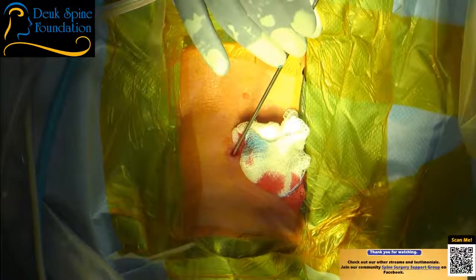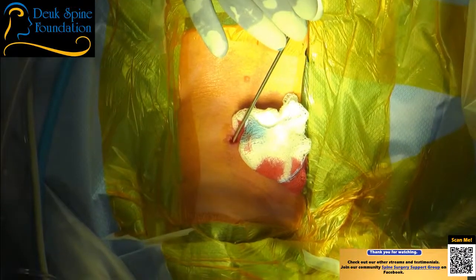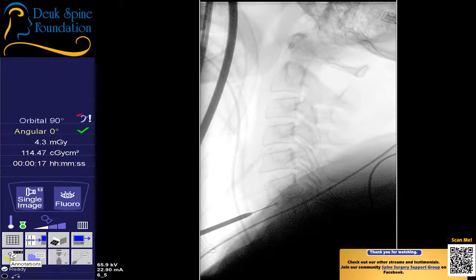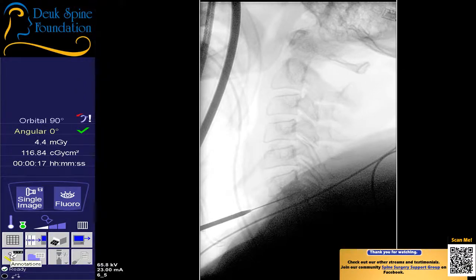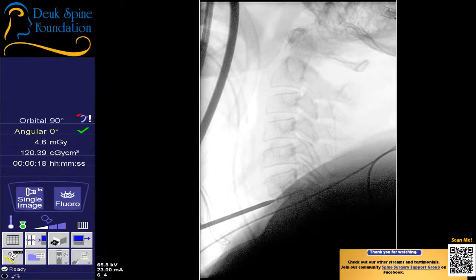All right, I need to see the guide wire. So pull harder and let's get a shot. Aha. So it has come back a little bit. Shot. Yeah, right there is good. Shot. So you got to be mindful of the guide wire and make sure it doesn't migrate or move while you're doing the surgery. Shot. All right, so at this point I'm ready for an AP view, Coker.